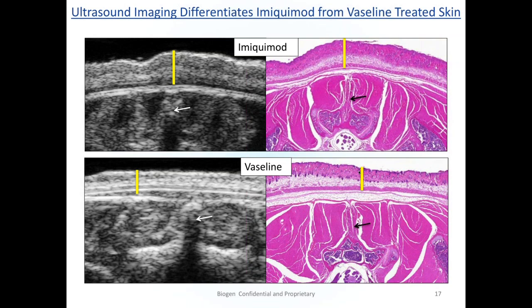Yeah, I guess when you're getting down to that level, you're talking about really small capillaries where the flow is just so much slower that you may not have sensitivity for Doppler, and then if you go with the nonlinear contrast, you're using a lower frequency probe, and it may be difficult. I'm just wondering off the top of my head about photoacoustic imaging, where you could use a high frequency probe and then you're just looking at the contrast of the hemoglobin to be able to measure some differences.